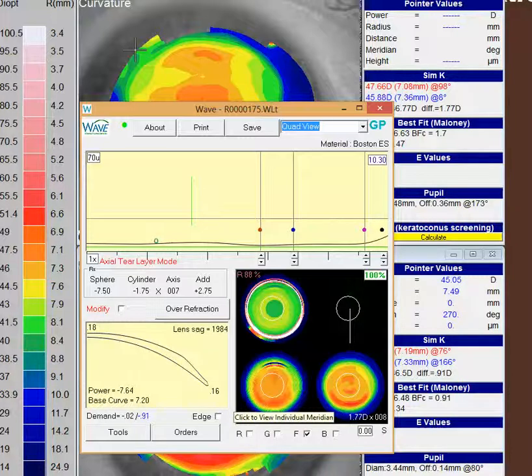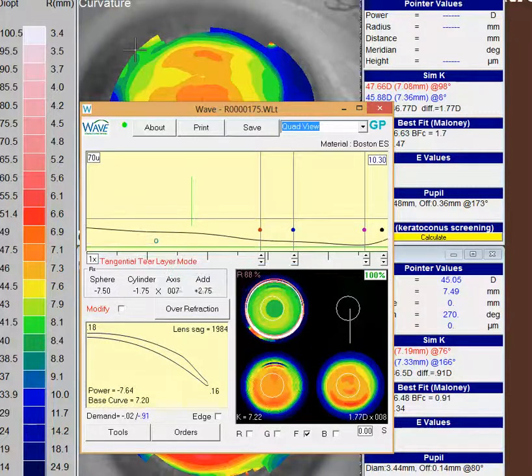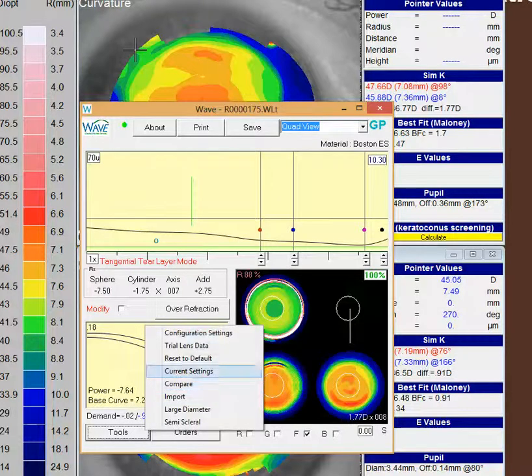Now what I might be inclined to do is actually just keep it in free form, click over here from axial over to tangential design. Tangential design tends to flatten up this periphery a little bit. It's probably about a half-diopter flatter and so if we do that.